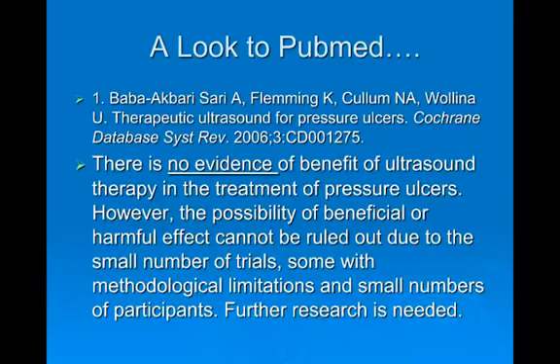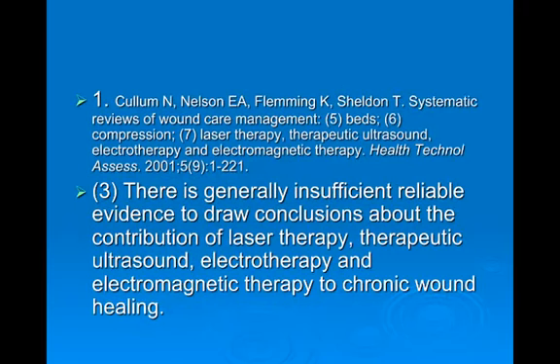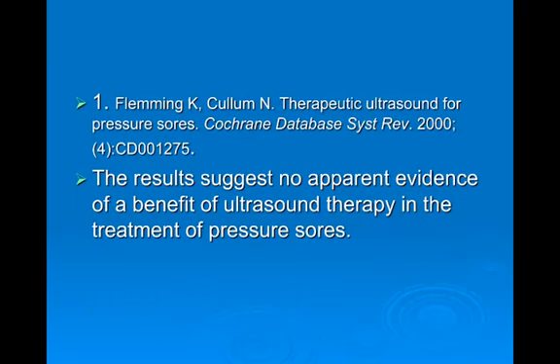Okay, same guys, different journal though. Actually, I'm going to skip down one more slide because I was expecting this one next. Pressure sores, same guys. Okay, so another Cochrane database review from a few years earlier. No apparent evidence of benefit of ultrasound in the treatment of pressure sores.